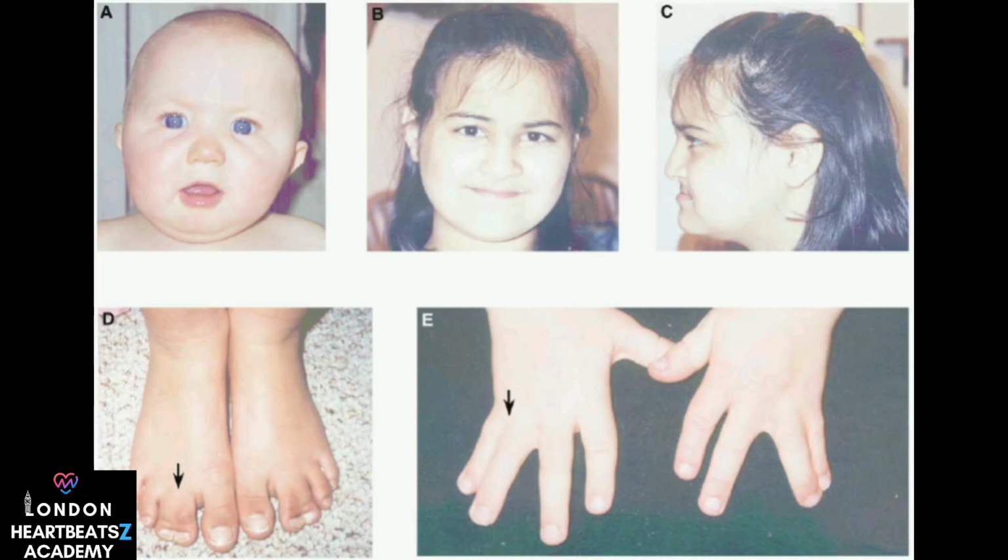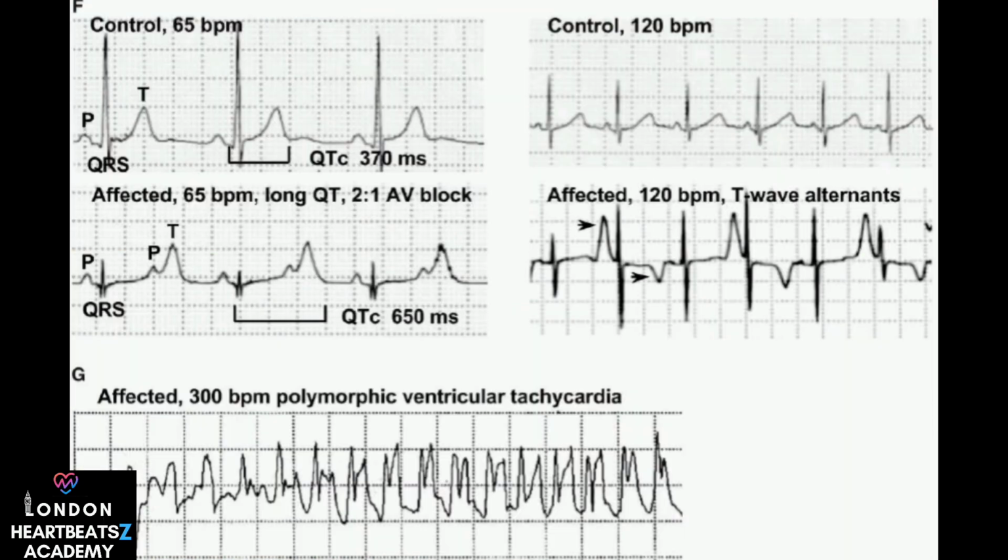All TS patients exhibit prolonged QT intervals. The QTc typically exceeds 480 milliseconds in TS1 and sometimes surpasses a staggering 600 milliseconds in TS2. Very, very long. One study found that almost half, 47% of patients, had a 2:1 atrioventricular block, meaning only every second electrical impulse from the atria gets through to the ventricles. About 6% experienced bradycardia due to sinus pauses. Additionally, 47% displayed T-wave alternans, that warning sign we discussed earlier, associated with lethal arrhythmias. Life-threatening arrhythmias like ventricular tachycardia, ventricular fibrillation, and cardiac arrest have all been reported in TS patients.